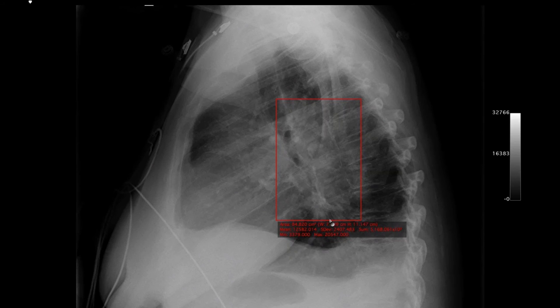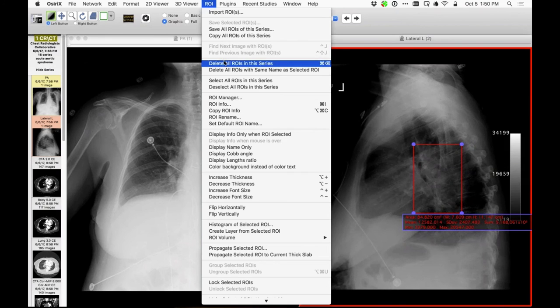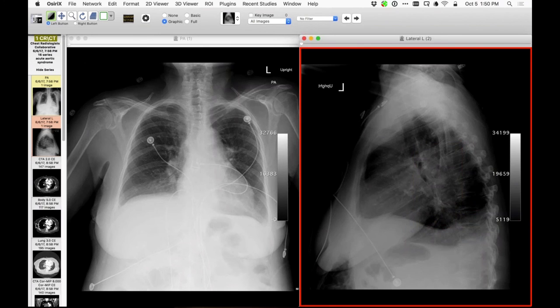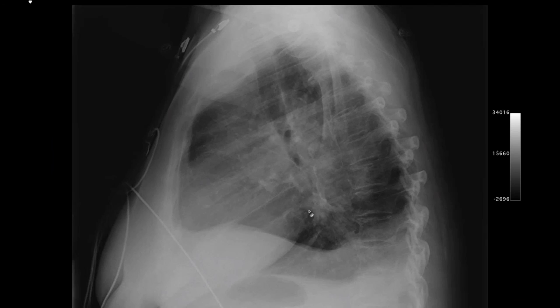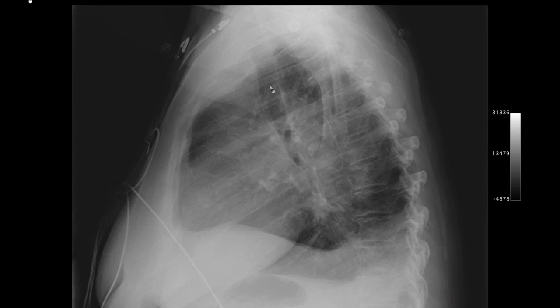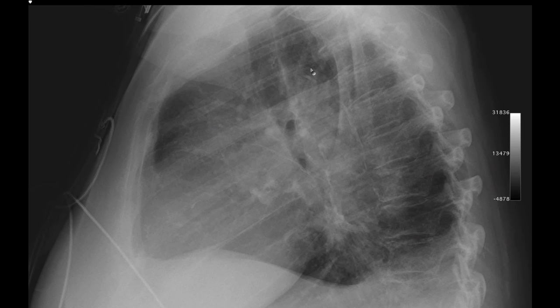So let me make that go away. Let's see if I can just make that go away. Second. And then I will bring in the lateral projection. Oh, the other thing I want to show you before I do that, now that I remember, is right up here, if you look at the location of the calcified atheromatous plaques in the aorta, they appear to be okay, except here, where there seems to be, if this is the aortic wall up here, too much distance between what may be the aortic wall and the intimal based calcified atheromatous plaques.